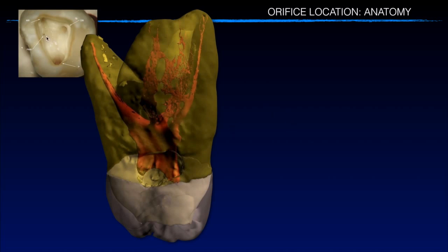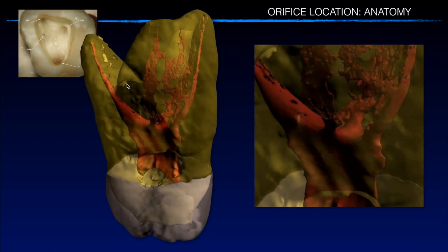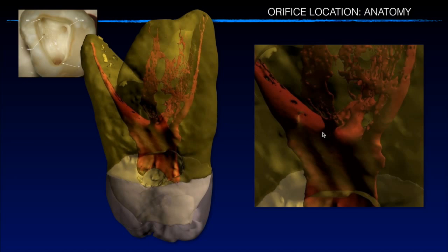Oftentimes you find that little orifice — it's right there. You get a number 10 hand file, travel maybe half a millimeter, and you bump into a dead stop. If you look closer at this example — a real tooth — here's the palatal root, here's the mesial root facing from the mesial aspect. This is your mesial buccal canal and this is your MB2. There's a lot of branching in between. The orifice of the MB2 branches out in several spots, so your task is not only to find the orifice up here, but to find which branch leads you to length. To do that, you often have to shave off dentin from the top of the orifice — trough in that area — to guide you to the main opening and to length.